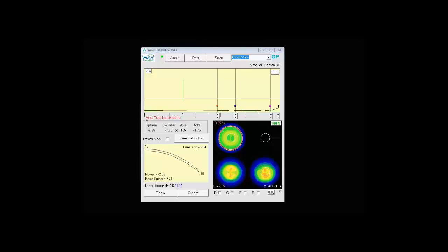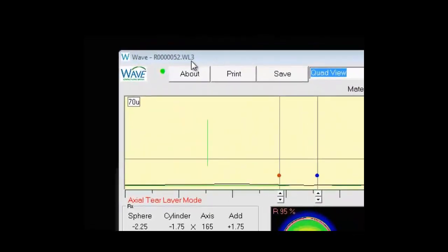So here we have a WAVE lens open, and we'll start at the upper left screen. We have WAVE, dash, and then a file name. The .wl3 in this case indicates it's the third lens based under a topography. If we had four, five, or six lenses under there, we'd see .wl4, .wl5, and .wl6.